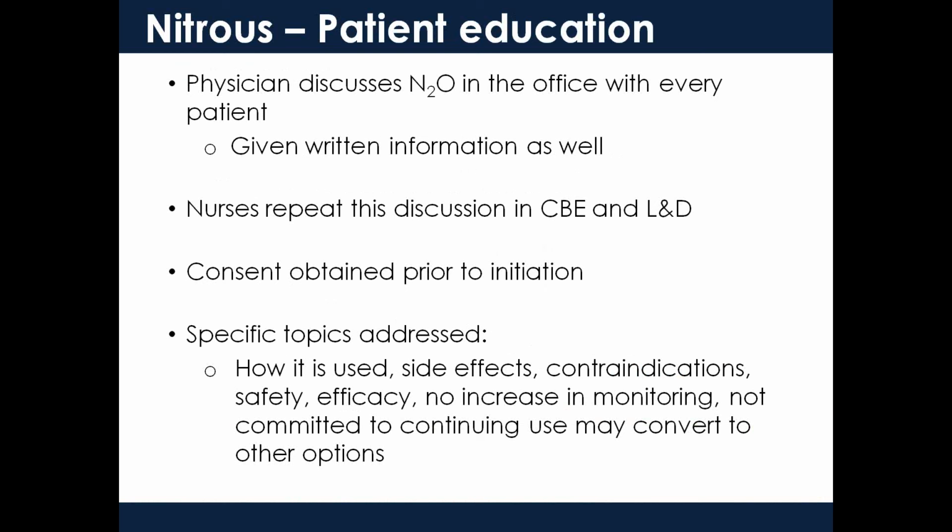Typically, patients are pretty self-limiting. So if they're feeling a little wobbly, they're the ones who say, well, I think I'll go from the tub to the chair, from the chair to the ball, from the ball to the stool. So with our support in the room, typically, like I said, 15 minutes is about what we'll say. But if you haven't gotten a good sense of how the patient's responding to it, then we would wait a little bit longer.